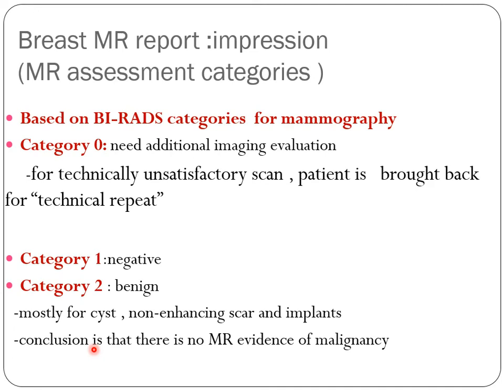The breast MRI reporting impression, based on the BI-RADS category, is the same as for mammography. Just the category of BI-RADS 4 is not divided into 4A and 4B, only BI-RADS 4 in the breast MRI.